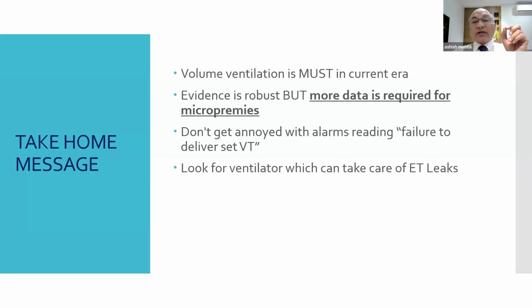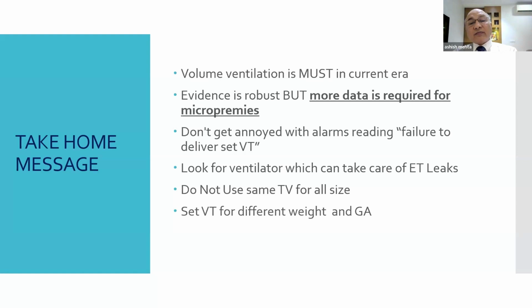Look for a ventilator which can take care of ET leaks. Look for the ventilator which has leak adaptation, leak compensation. These are important before you say that you failed to deliver the set tidal volume. Because of the leak, and the non-availability of leak compensation, at times the ventilator will fail to deliver the desired tidal volume, and then you get annoyed. Don't do that. Try to select the right ventilator which can help your baby.